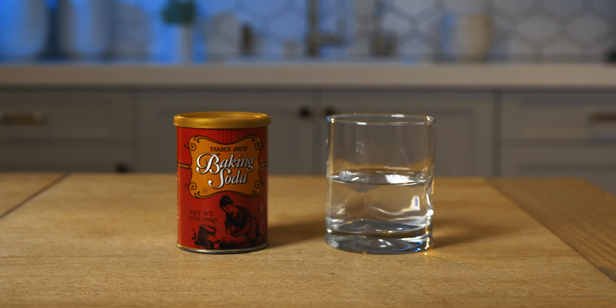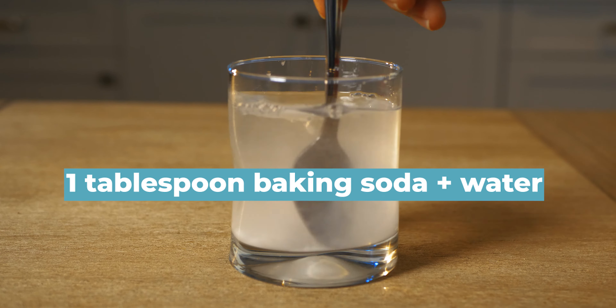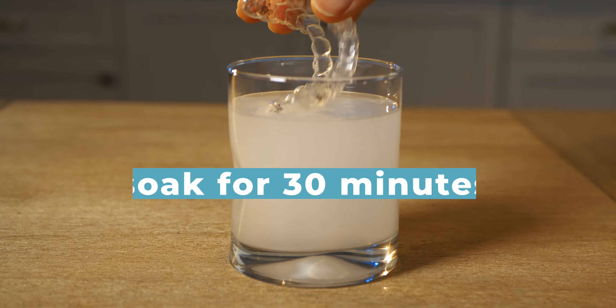The second method is baking soda and water. Mix a tablespoon of baking soda with a cup of warm water, then soak for 30 minutes.